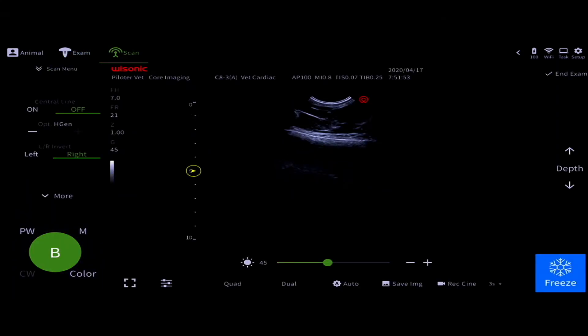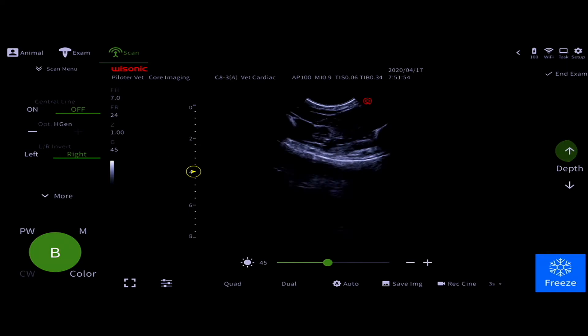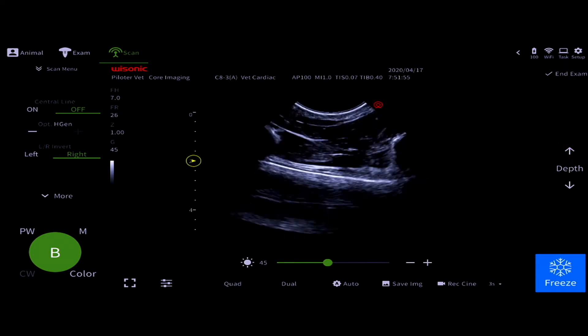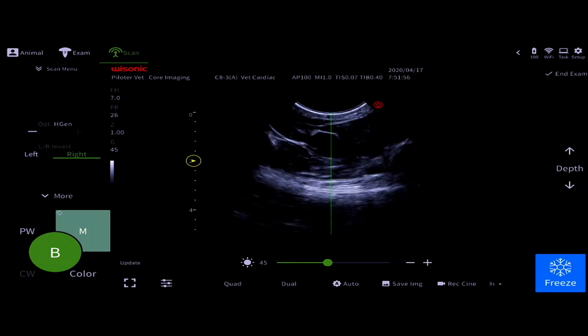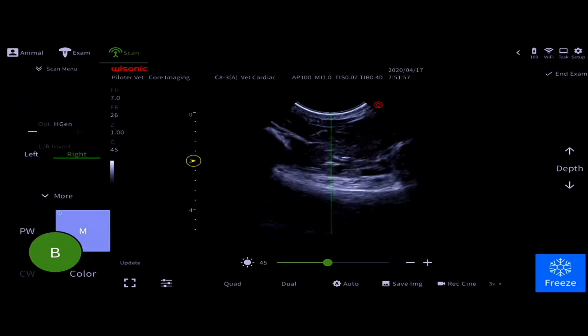Once you have the image where you'd like it to be, with depth and gain, press the M-Mode button.